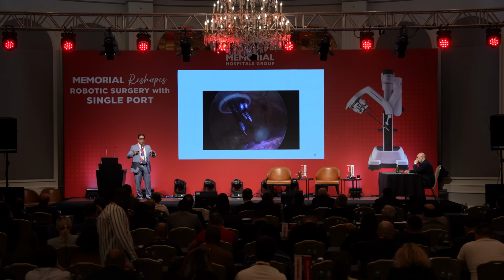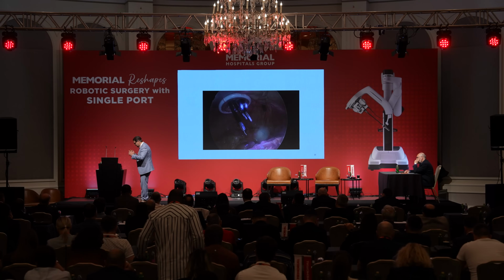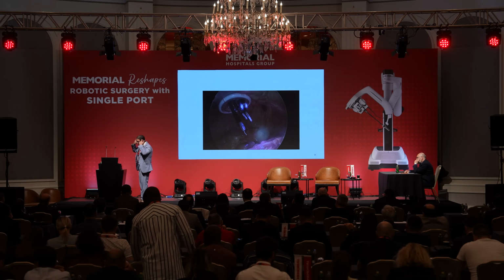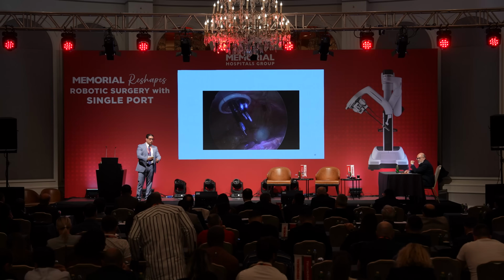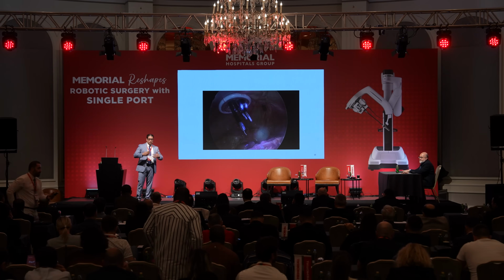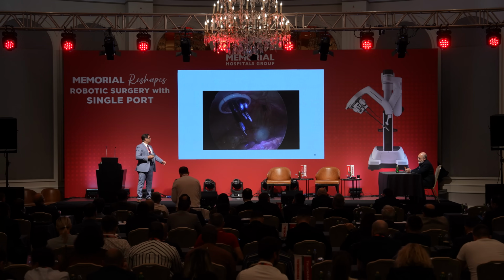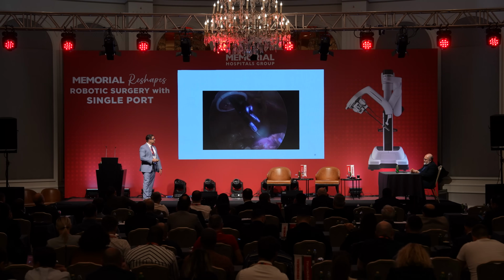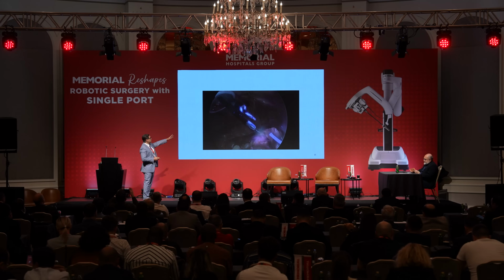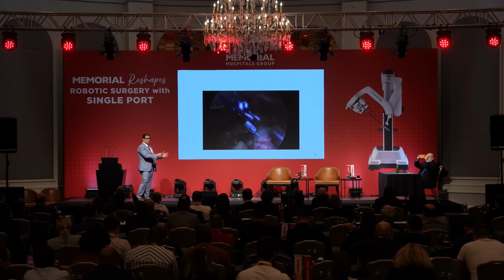For those people here who are doing robotic surgery, you know you are sitting on the console and your head is envisioning what's happening on the table. External collision, internal collision. You do it so much that you actually adapted that memory of vision. We don't have this here. So I needed to know what happened when I move my arms. This is how it works. So it goes in, and it works, as I said, it moves in groups.